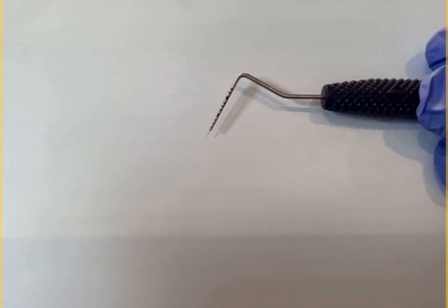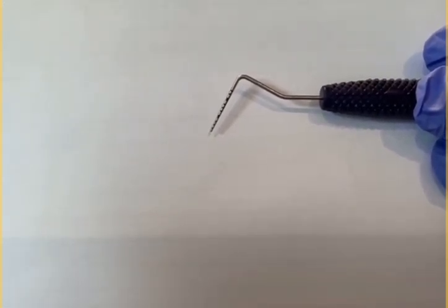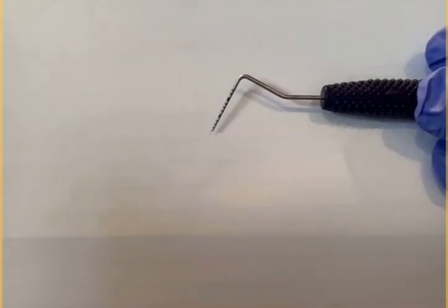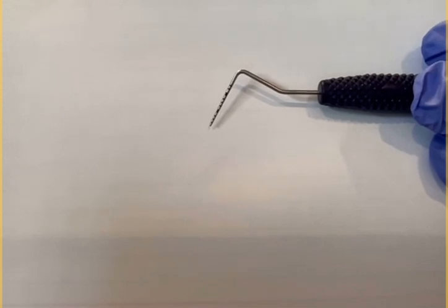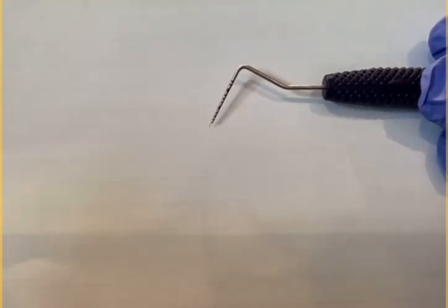as a dental abscess. Each tooth is split into 6 parts: distal line angle to interproximal, distal line angle to mesial line angle, interproximal, both on buccal and lingual, making 6 parts per tooth. The deepest probing depth between each part is recorded, with 6 measurements per tooth. The probe is held with light grasp and light pressure when probing so as not to cause injury.